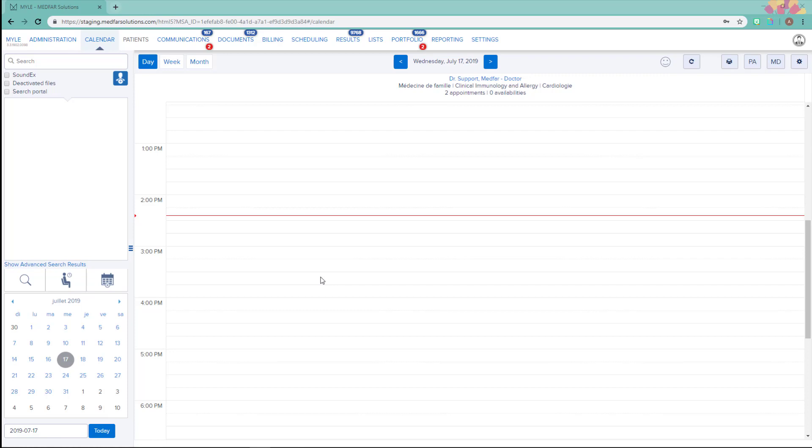In the following video, you will learn to view, print, and import results available in the DSQ directly in MYLE.